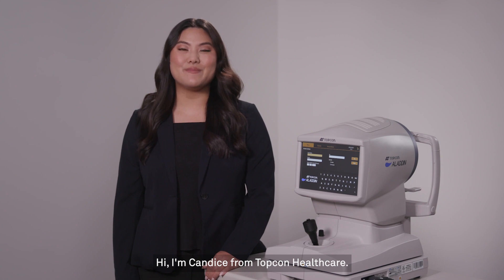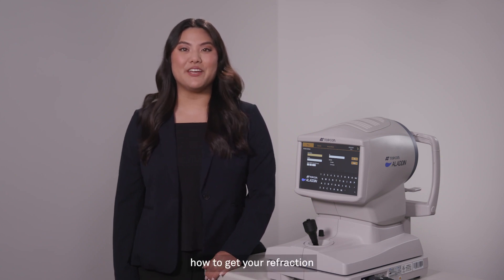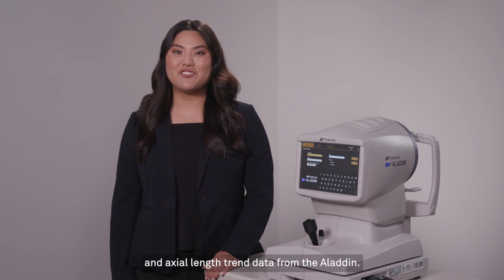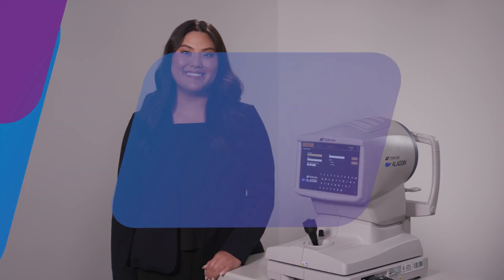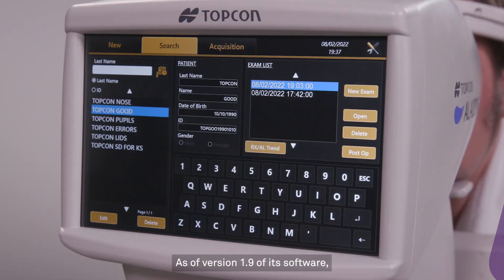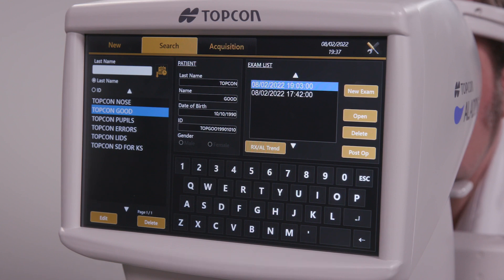Hi, I'm Candice from TopCon Healthcare. Today I'm going to show you how to get your refraction and axial length trend data from the Aladdin. As of version 1.9 of its software, the Aladdin offers the option to measure and track patient's myopic progression.